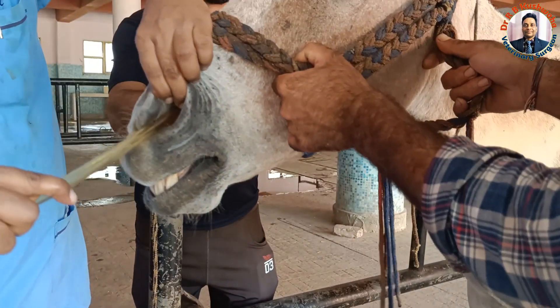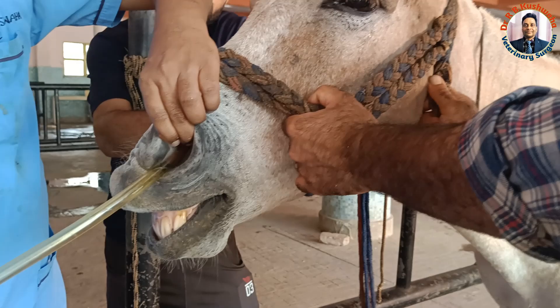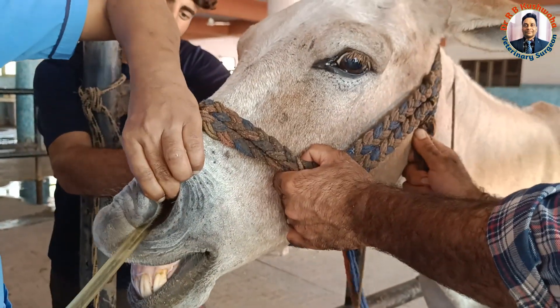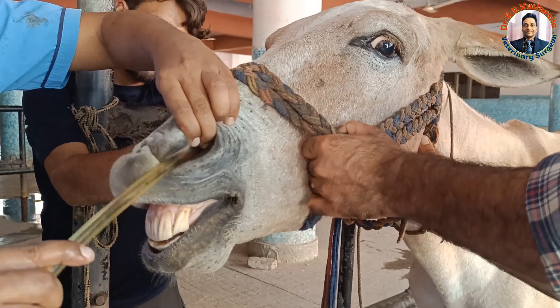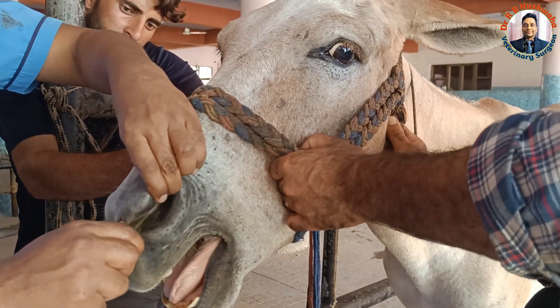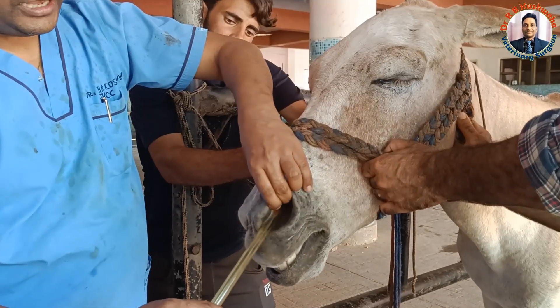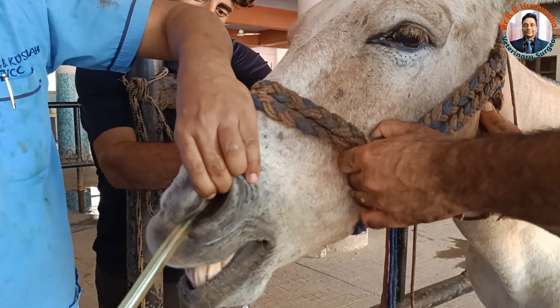Press the tube ventrally and medially. Otherwise, it may strike the ethmoid or nasal turbinate if you do not press ventrally. As you can see here, it is going very easily. It has now reached up to the pharynx. Now we wait for the swallowing reflex — the moment the animal swallows, you can pass the tube further.